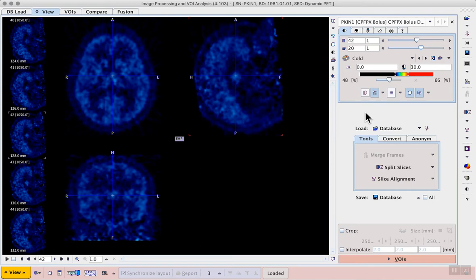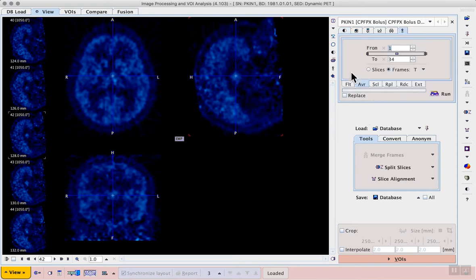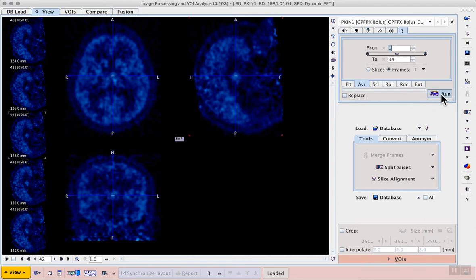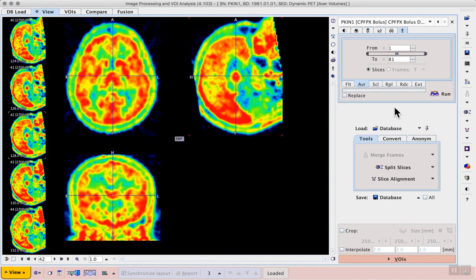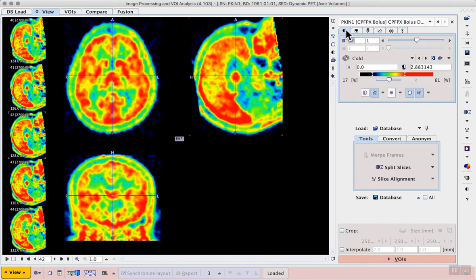A good strategy to see the anatomy more clearly for drawing VOIs or checking the location of loaded VOIs is to create an average image. Use the tools tab, averaging sub-tab, and create an average of all time frames without replacing the dynamic data.